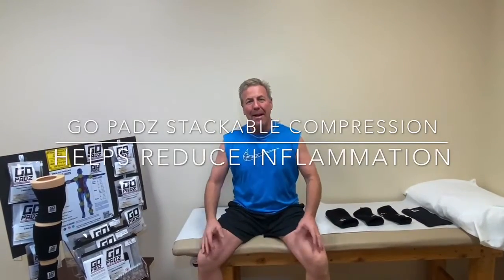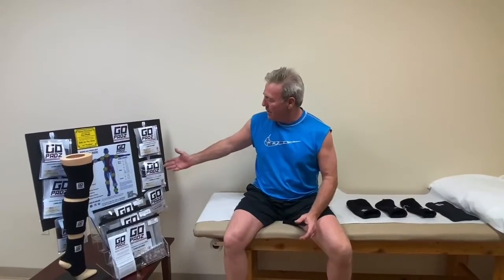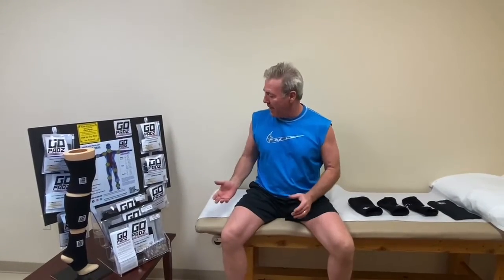Hey, this is John Murphy and I'm at my doctor's office. To the side table here is a beautiful GoPads display, and that's really how I first found out about GoPads.